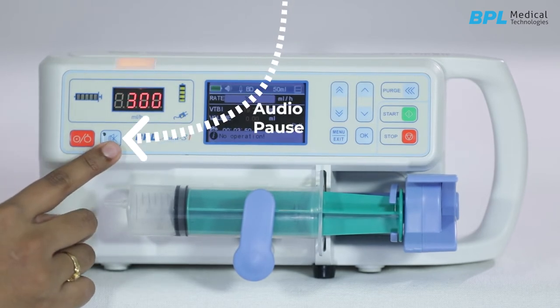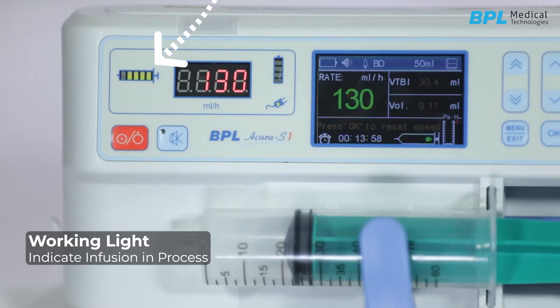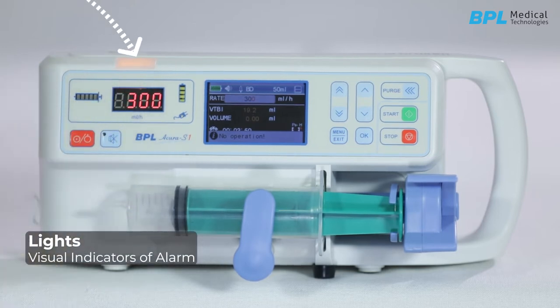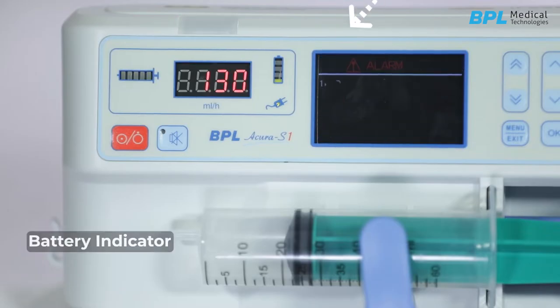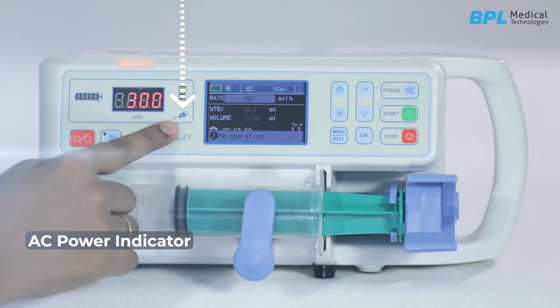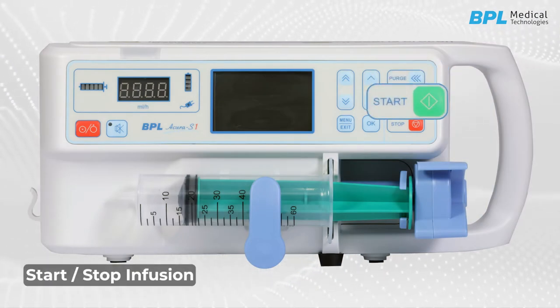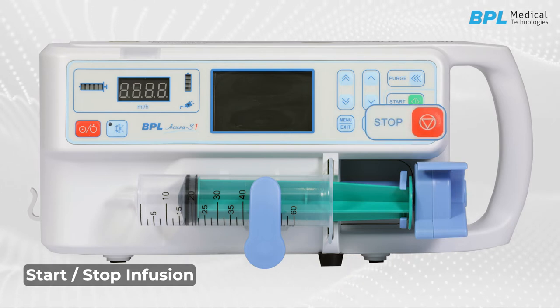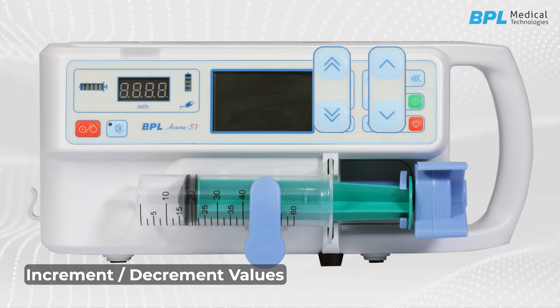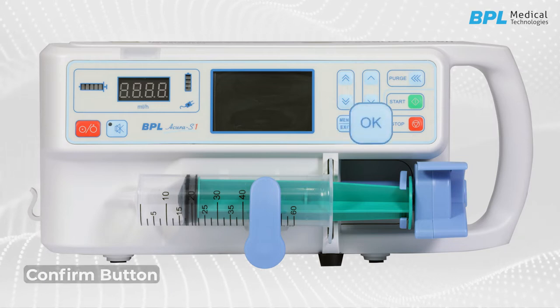This is the audio pause button to silence the alarm. This is the working light which indicates infusion in process. This is the light for visual indicators of alarms. This is a battery indicator. This is the AC power indicator. This is the purge or bolus button. This button is to start the infusion and this button is to stop the infusion. These are the keys used to increment or decrement the values. This is the menu or exit button, and this is the confirm button.